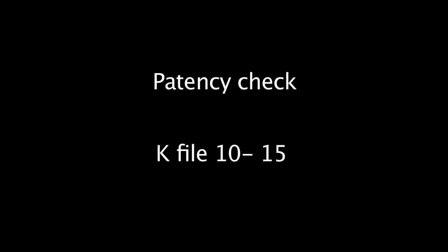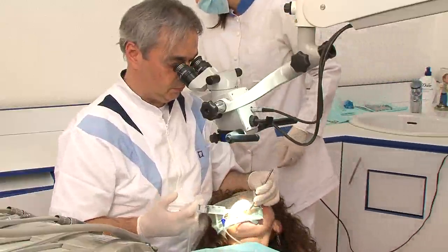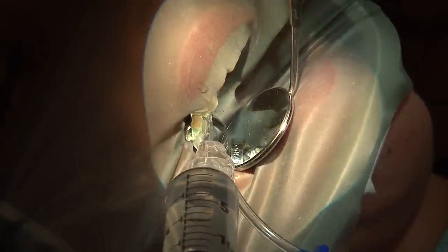The next step is patency check done by a K file size 10 or size 15. In slow watch winding movement, we just check the patency of our canals. Our goal is not to reach the working length or the apical area at this time, just to check if the canals are patent and can accept our rotary files. After patency check, all the debris are taken out with the Indovac.